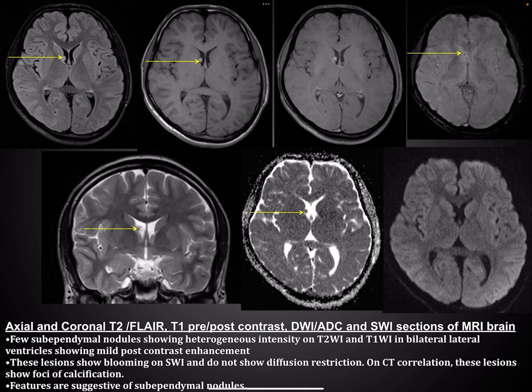Another case shows axial and coronal T2 FLAIR, T1 pre- and post-contrast, diffusion and susceptibility weighted images. Few subependymal nodules are noted in bilateral lateral ventricles showing heterogeneous intensity on T2 and T1 weighted imaging, with mild post-contrast enhancement and blooming on SWI, and do not show any diffusion restriction. On CT correlation, these nodules were calcifications — features suggestive of subependymal nodules.